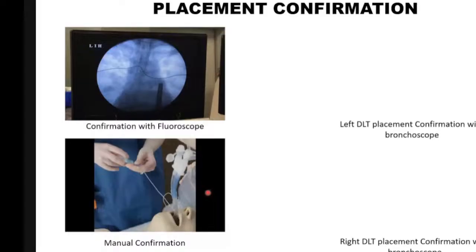Now in step 4, we just do the reverse. We release the previous blocker in the intended lumen, the left side of this, and then again we can see only the other end is there.